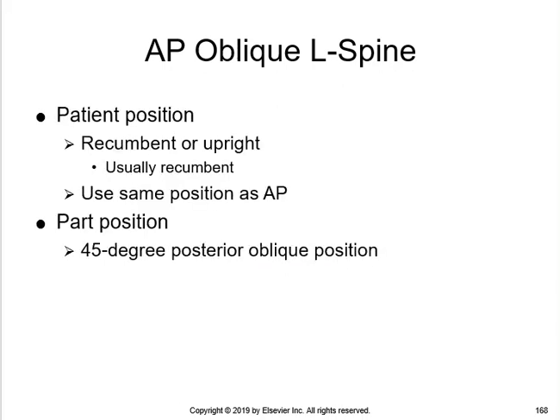How you're going to position your patient is with the patient flat on their back. From a flat on their back position, you're going to rotate into both an LPO or an RPO position. So you're always going to shoot bilateral obliques.